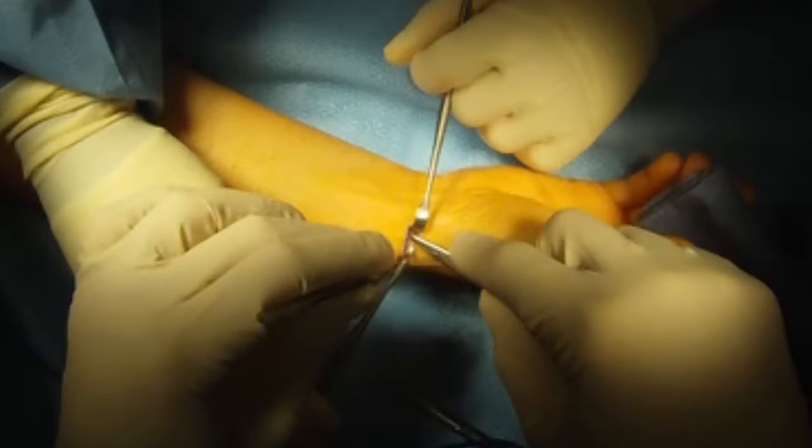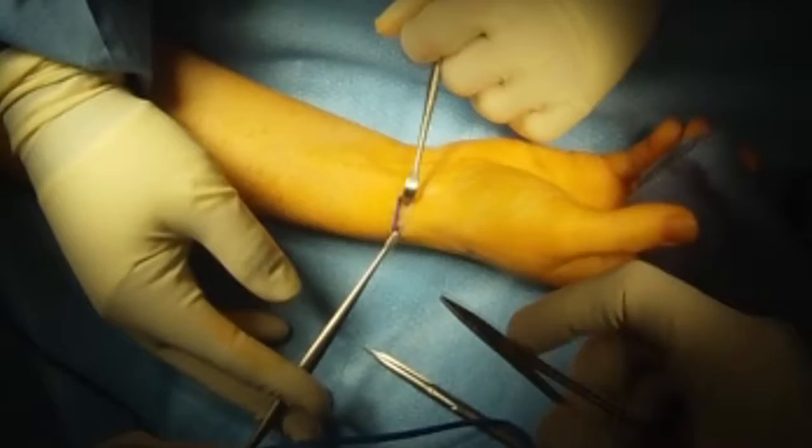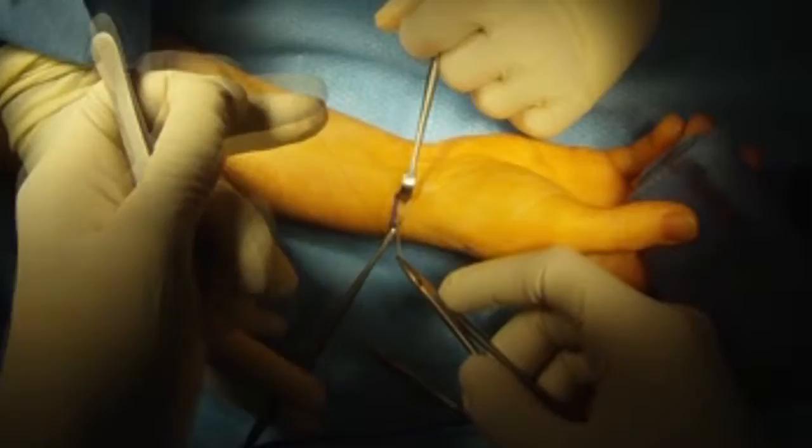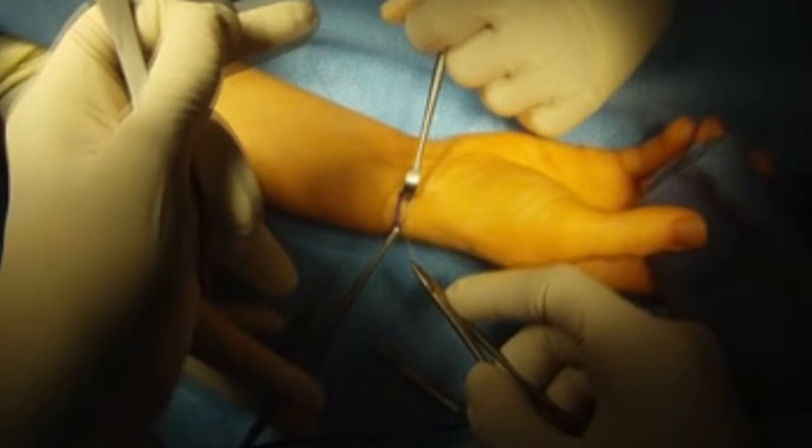This allows the wrist to be splinted for a shorter period of time. I check to make sure it's not constricting the tendons. Then stitch it up with absorbable stitches. All done.